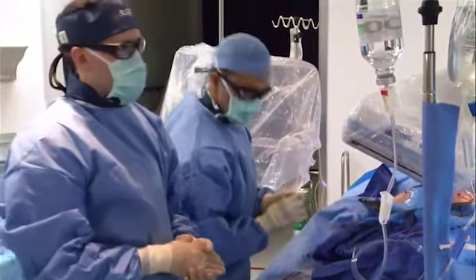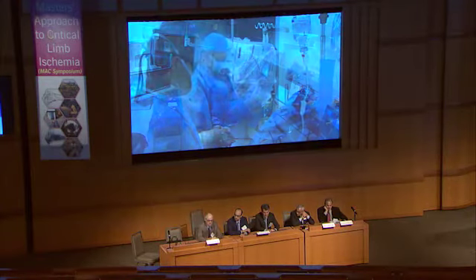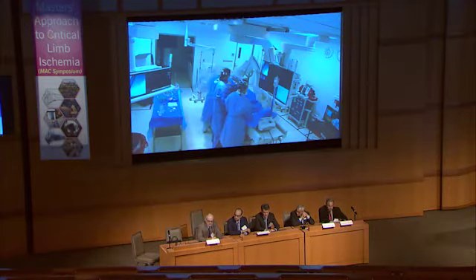Why are you intending to go through the popliteal? The most important artery is the anterior tibial artery, which is almost patent down to the foot. There is an area at the origin which might be diseased, but everything else is patent. So why don't you use the anterior tibial, which you will need to open for improving wound healing, number one. And number two, you also have disease of the deep femoral artery. Are you intending to treat this as well?